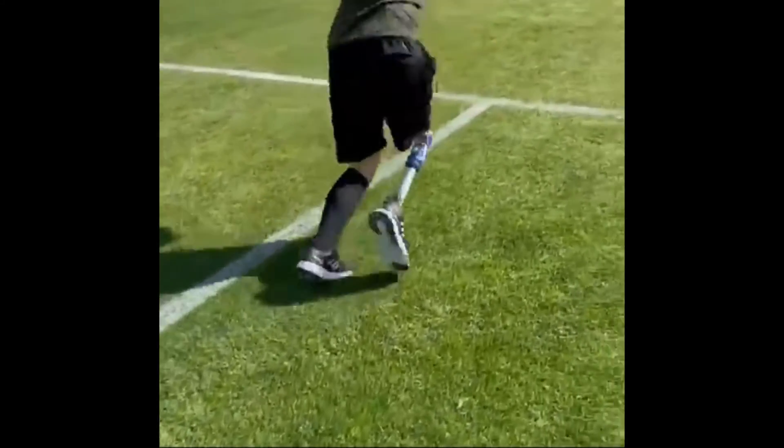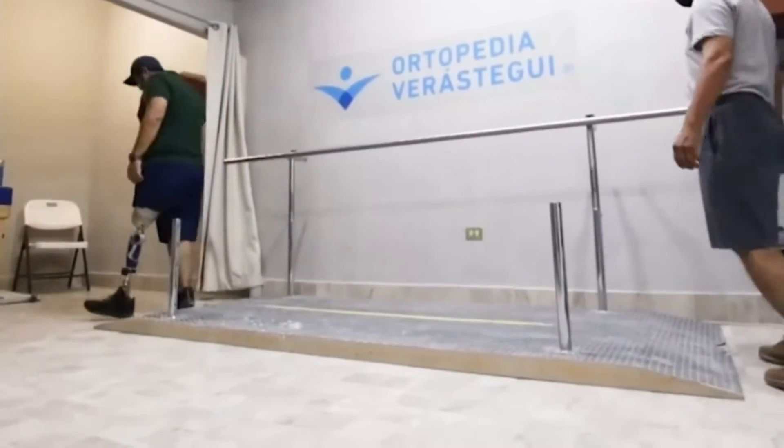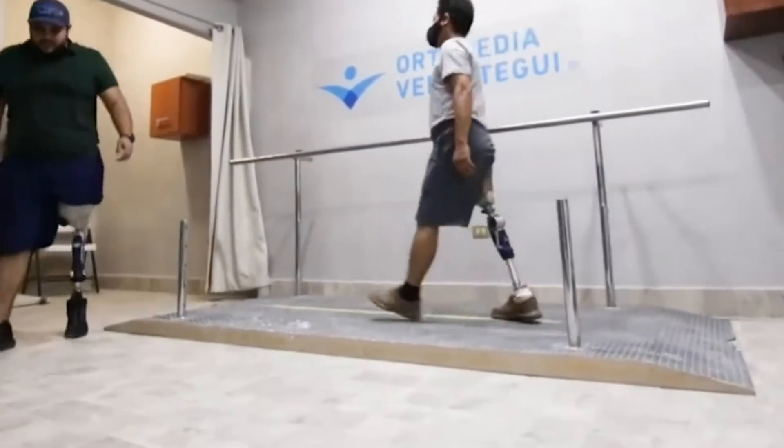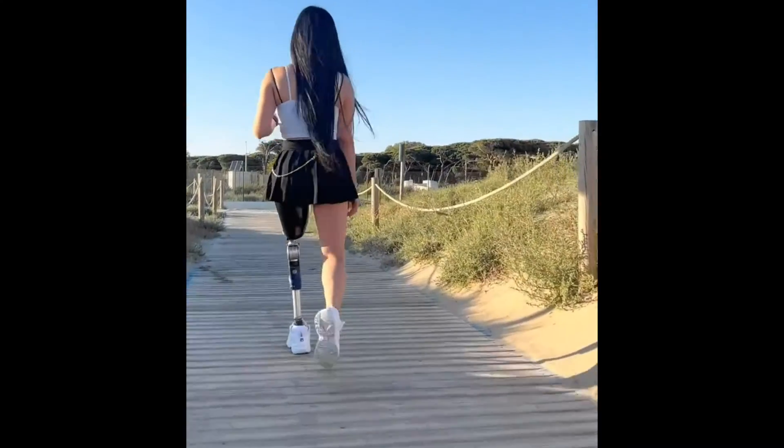Fabricating a prosthesis that is optimally tailored to the patient demands technical knowledge of orthopedic technology. Alignment and adjustments may only be carried out by a prosthetist. Alignment and adjustments are mainly completed in the following steps.